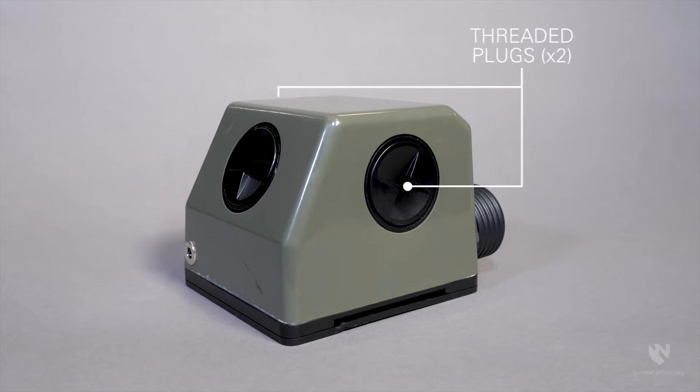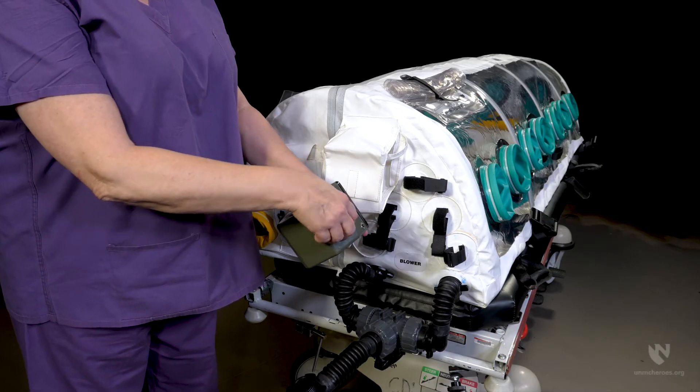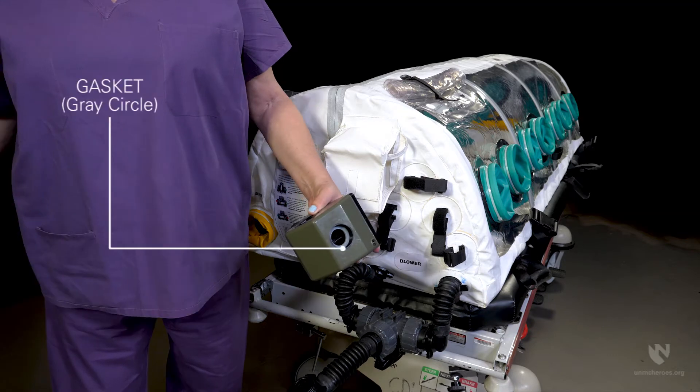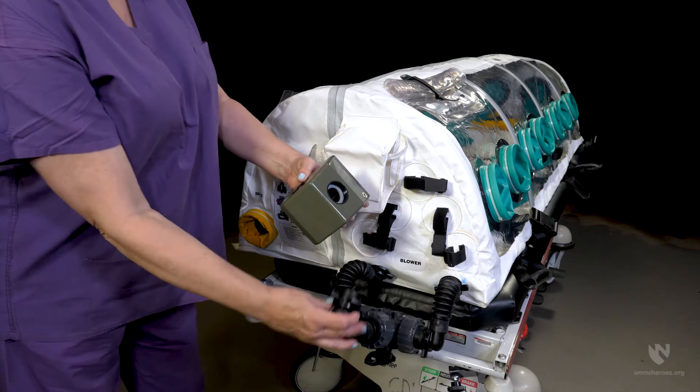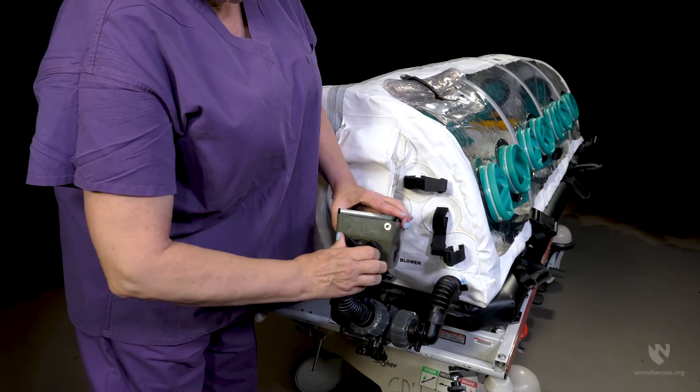Thread the female end of the remaining breathing hose onto the top of the three-way valve. Ensure the side ports on the blower motor have gaskets and a threaded plug installed. Remove the filter port plug on the top of the blower motor and ensure the gasket is present and intact. Finally, thread the unattached male end of the breathing hose into the top of the blower motor and hand tighten.